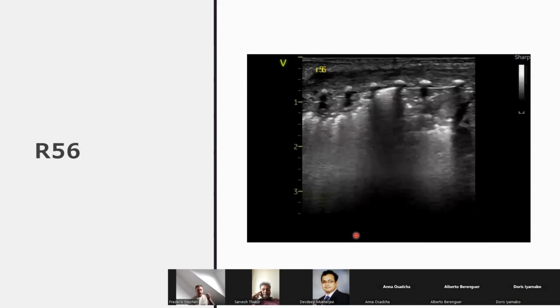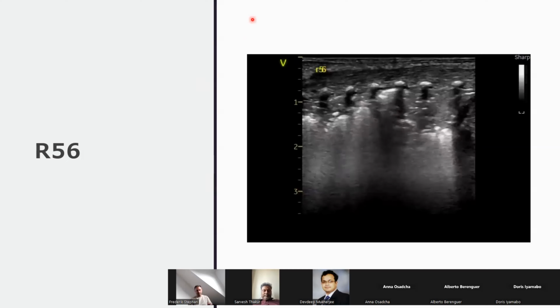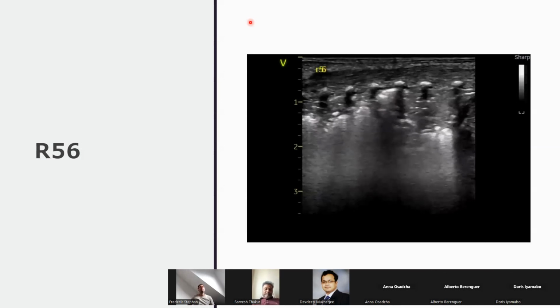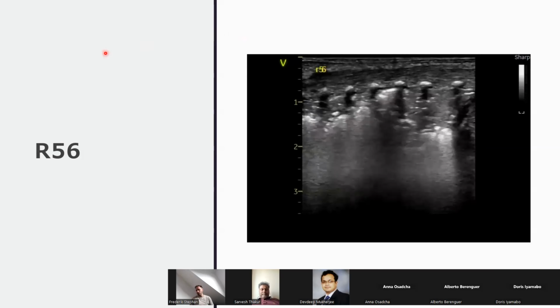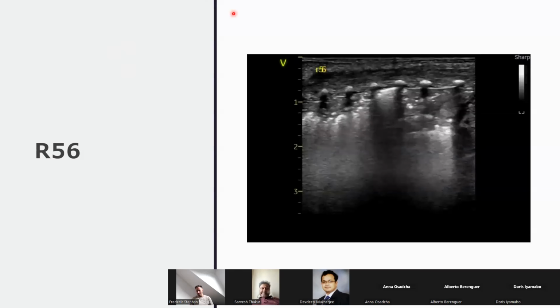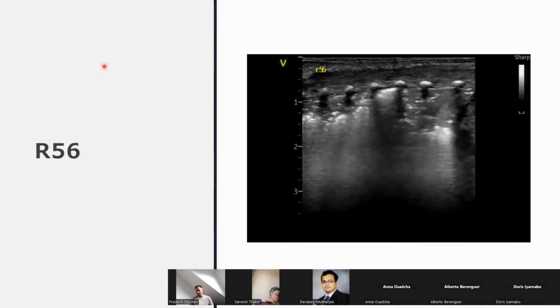Are you happy to make any changes on the ventilator? I suppose just the one thing that's occurred to me there, they're on volume guarantee. So is there a large leak or has something changed about what's delivered to the baby? Nothing like that, but well done. I would completely endorse we need to do that. No leaks, nothing. So you're happy to go up on volume? You want to increase the PEEP based on this? Yeah, I'd probably place them prone if the baby was able to do so.